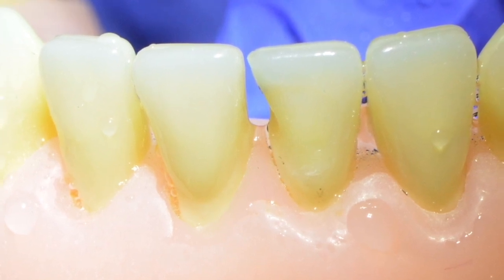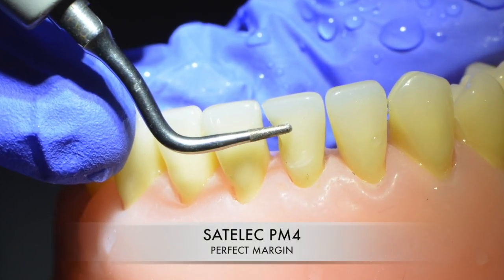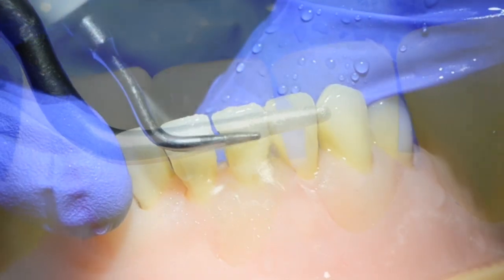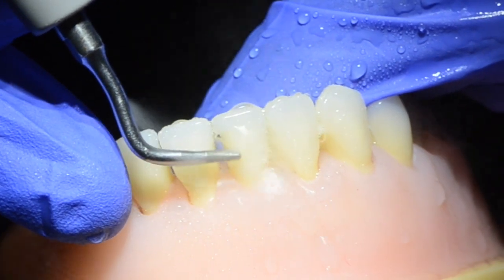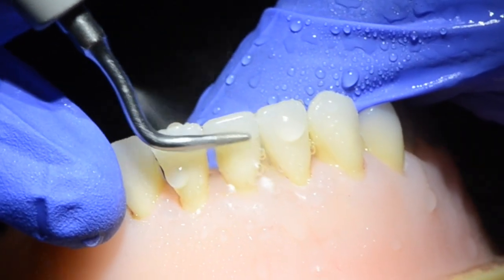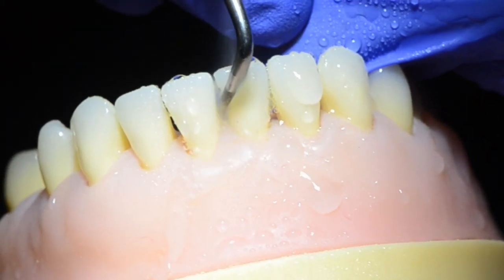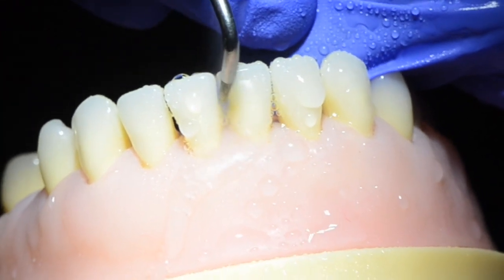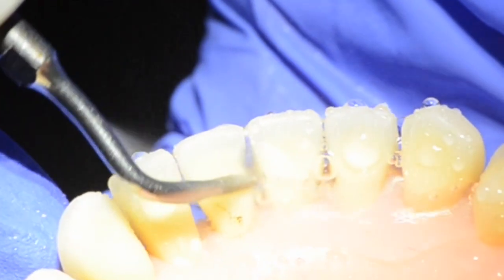I follow a meticulous regimen when it comes to tooth preparation, and that involves a series of steps starting with the football diamond, then the long tapered diamond, and then I use a PM4 ultrasonic tip — PM stands for 'perfect margin' — which helps to smoothen the prepared surface and iron out any rough edges after the previous steps.